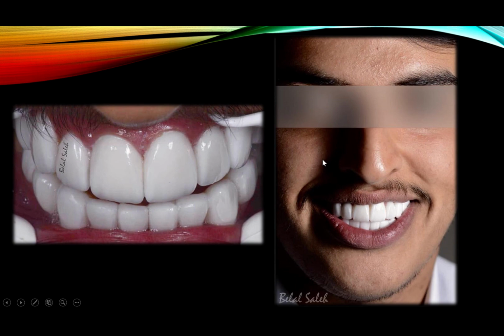Okay. This is a different case. This is even whiter. I know you guys hate me by now because of the very, very white teeth, but they're very popular here. They're very popular. You can barely layer anything on top of BL1. It's BL1. It's super, super white. And anything that you try to do bluish, grayish, enamelish, opal, everything tends to be minimum, because you're talking about BL1.